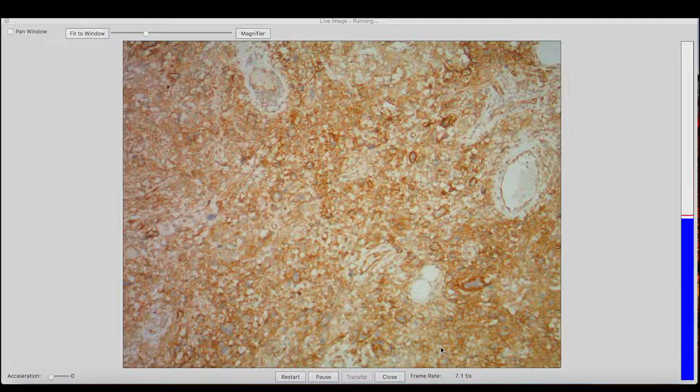Regardless, I don't necessarily think even a CD34 stain is absolutely necessary to do, although it is certainly confirmatory. The problem is, as I mentioned in my lecture on this topic, CD34 is not a specific marker by any means and can be found in virtually any other neoplasm if you stain enough sections of it, including well-differentiated liposarcoma, which is the only other reasonable lesion in the differential diagnosis.